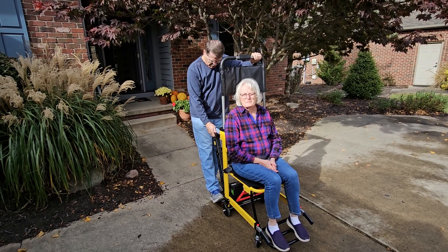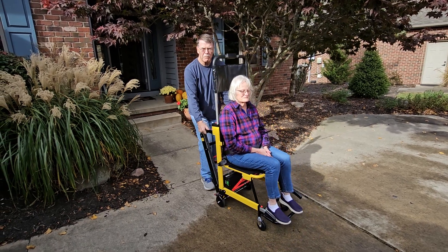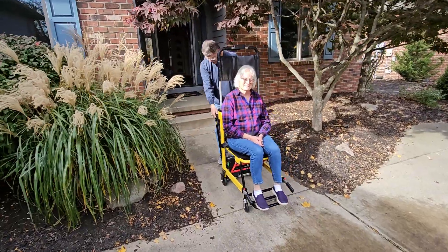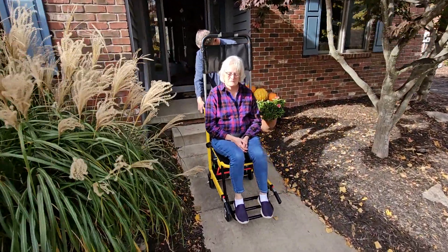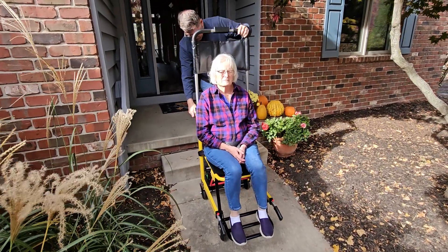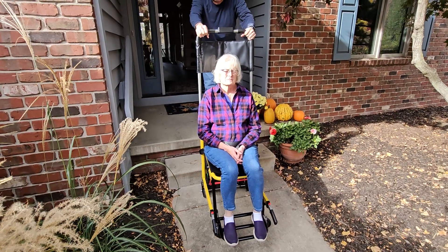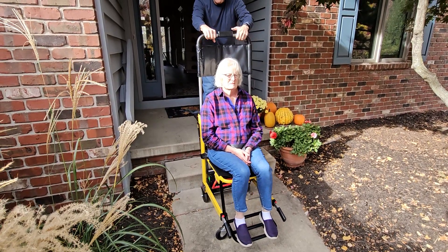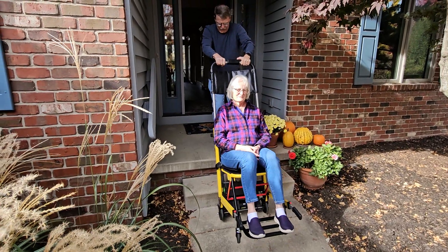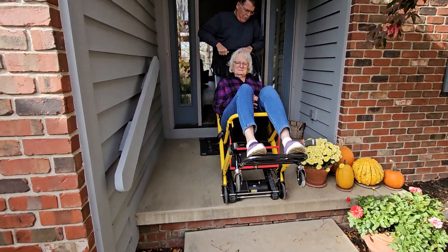Let me demonstrate. So, once you're in, we'll take the brakes off, and then we'll just pull this chair back to the steps. We'll go very gently here, and then once we get to the base of the steps, we're going to tilt this chair back slightly — it'll be somewhat like a recliner — and then you'll probably feel a little bit of vibration as the motor begins to carry you up the steps.